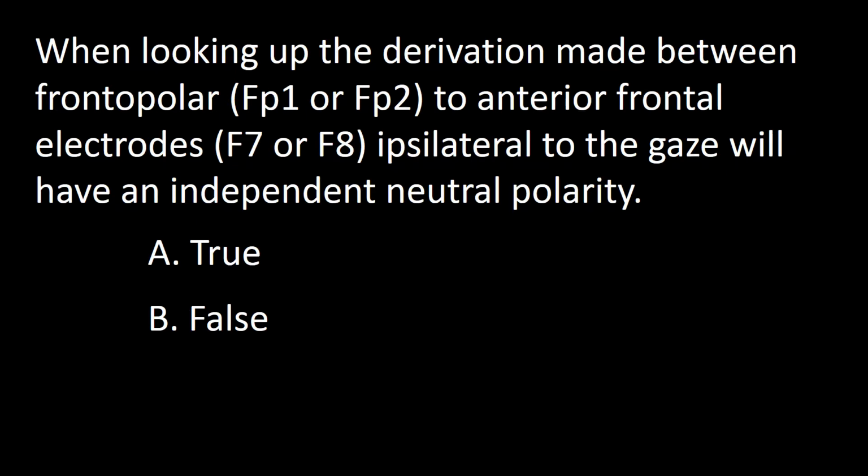Next question. When looking up, the derivation made between the frontopolar to anterior frontal electrode ipsilateral to the gaze will have an independent neutral polarity. A true, B false.